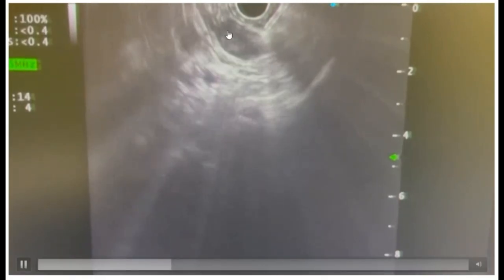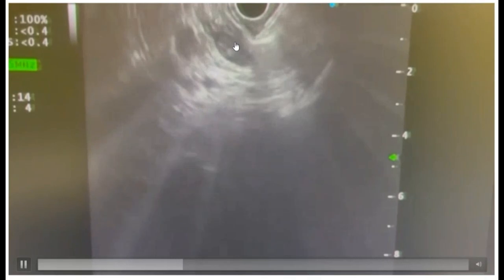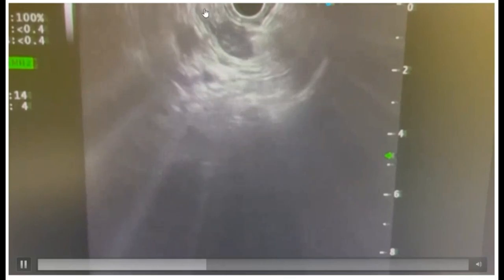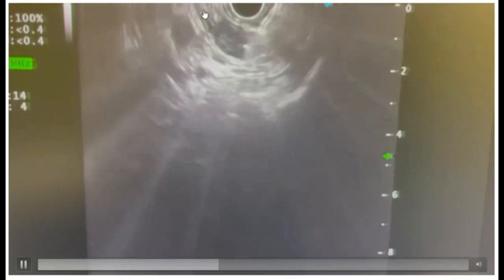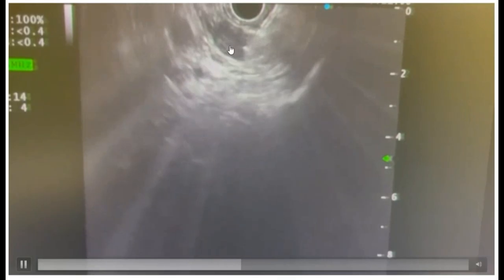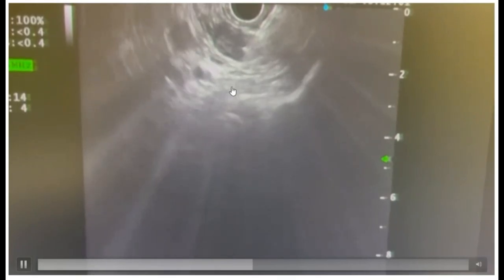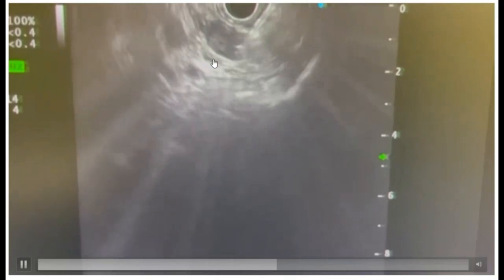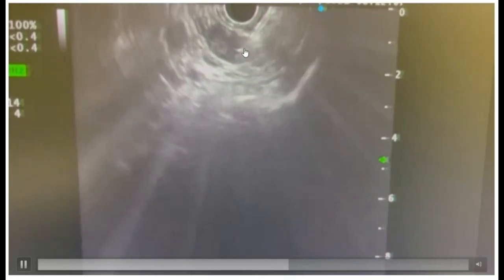Obviously the bird has become a fat bird here because of the metastasis. I say that because usually the adrenal looks like a seagull, a small bird, and when there is metastasis, it's enlarged and looks bigger than normal, obviously.